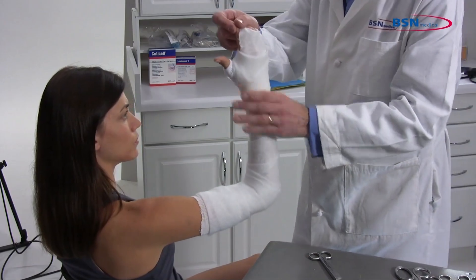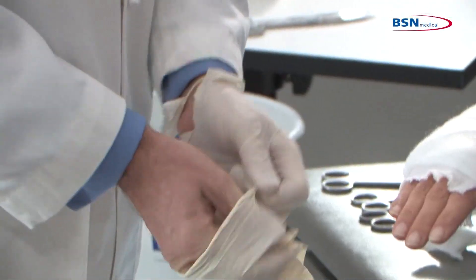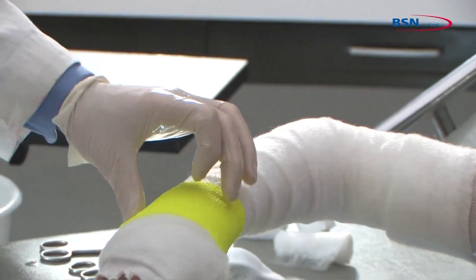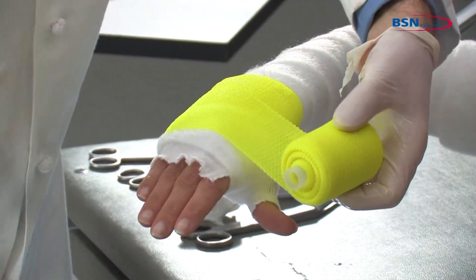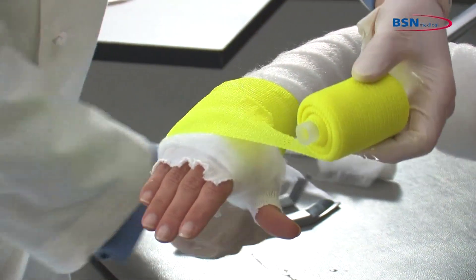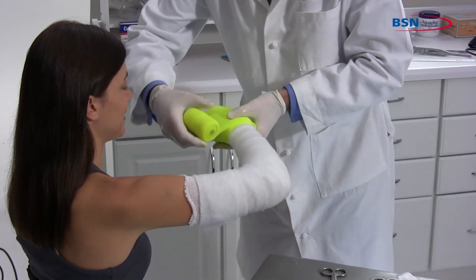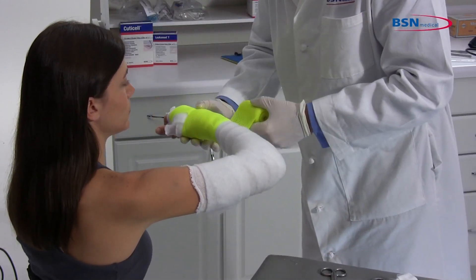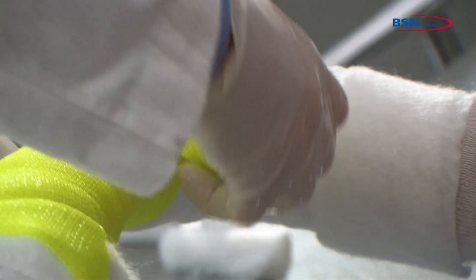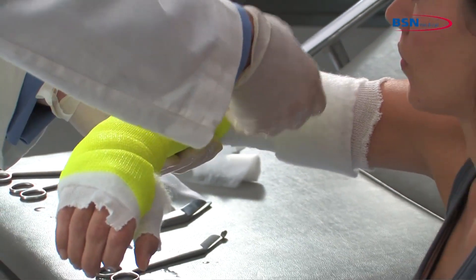Make sure patient limb position is correct before starting to apply the cast tape. Begin by putting on protective gloves before applying the cast tape. Dip 2-inch or 3-inch cast tape in water, squeezing 1-3 times. Remove from water and squeeze 1-3 times to remove excess water. Start wrapping the cast at the wrist and go through the web space, then go around the hand and continue with 50% overlap toward the elbow. Avoid placing the edge of the cast tape in the anti-cubital fossa and continue wrapping toward the upper arm.